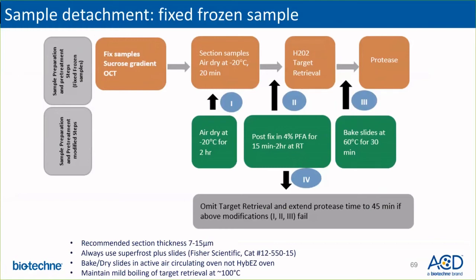After trying the above steps, 1, 2, and 3, as shown in the slide, if you are still observing detachment, we recommend you omit the target retrieval step and extend the protease time to 45 minutes. Also, please contact support and we can help you figure out the best troubleshooting path for this issue.